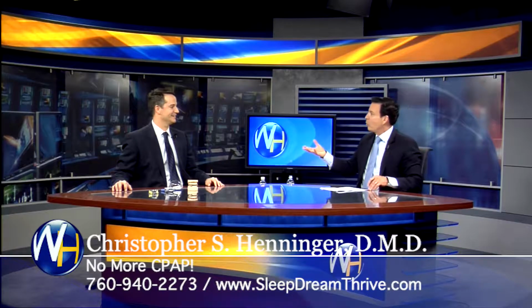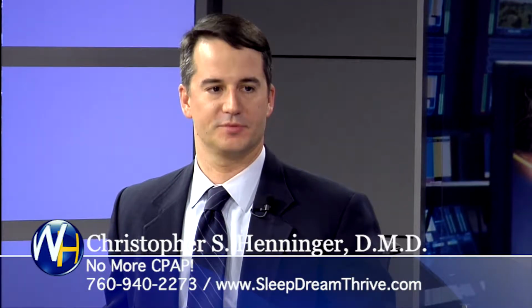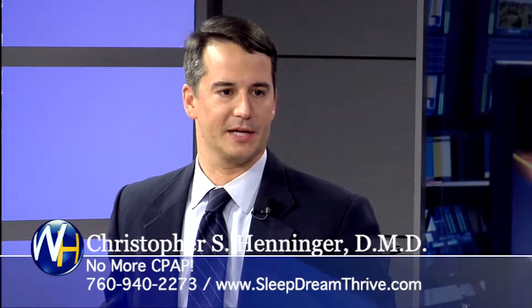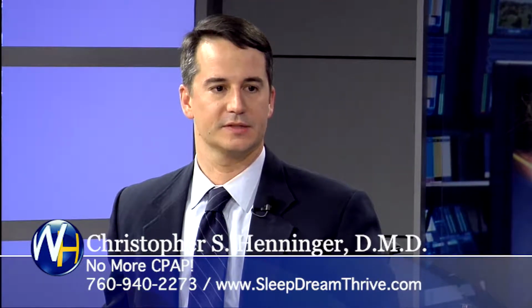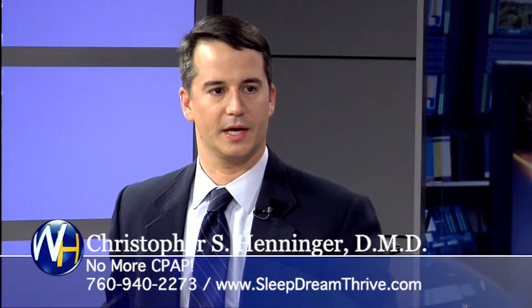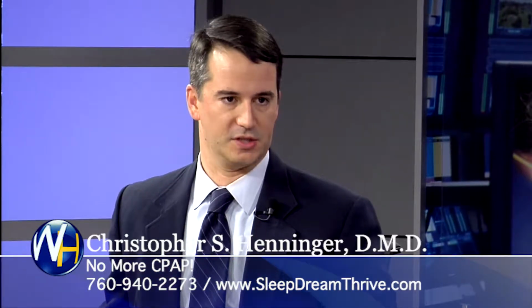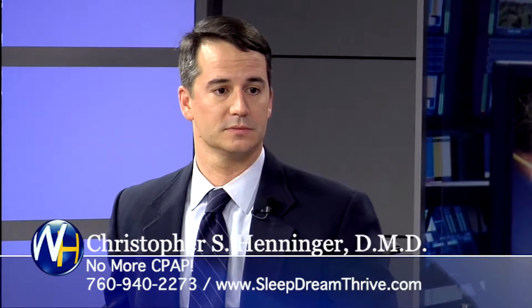Now, you say that this works, by the way. It's FDA approved for what? Right. It's FDA approved for the treatment of obstructive sleep apnea. So there's 3 different categories: mild, moderate, and severe. And even the Academy of Sleep Medicine recommends oral appliance therapy, which is a dental device. It's not made by a physician, it's made by a dentist, as the first-line treatment for mild to moderate sleep apnea.